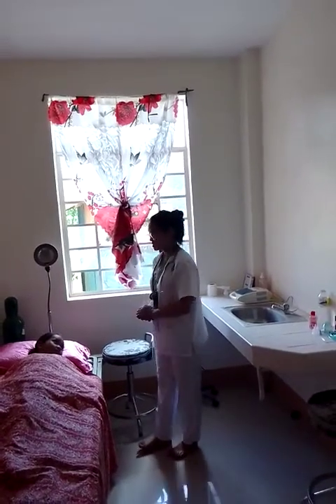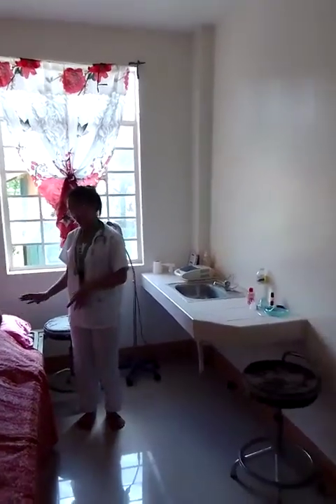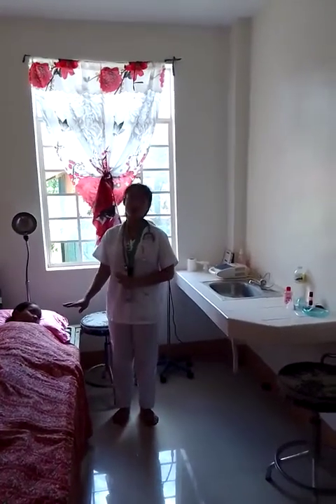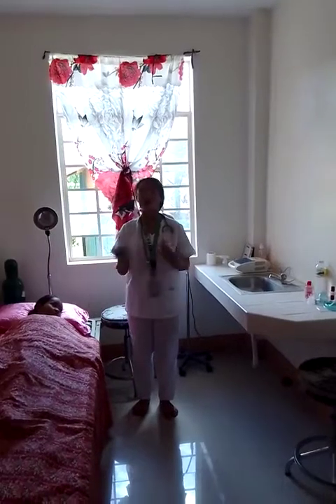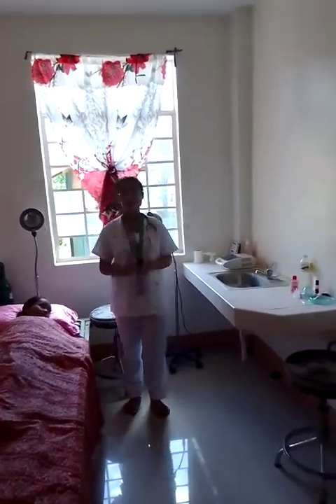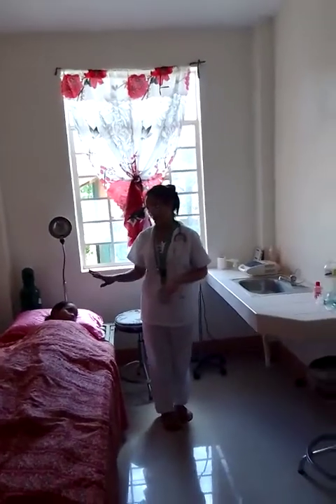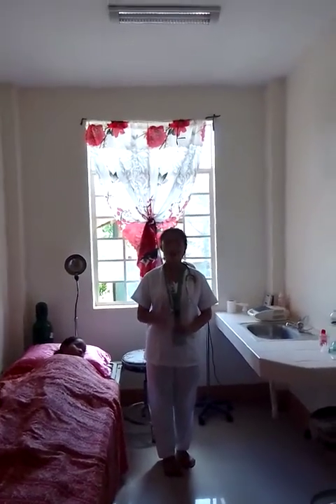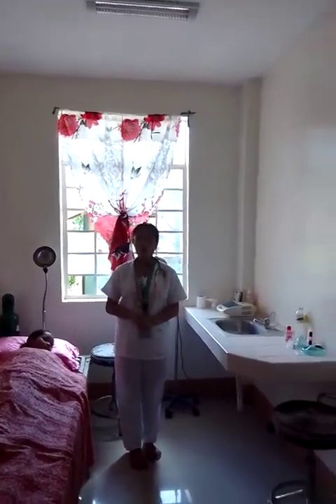Okay. Since our patient is identified and is the right patient for the procedure, we need to proceed to the next step. Before we do nebulization, we need to first monitor the heart rate of our patient before treatment.